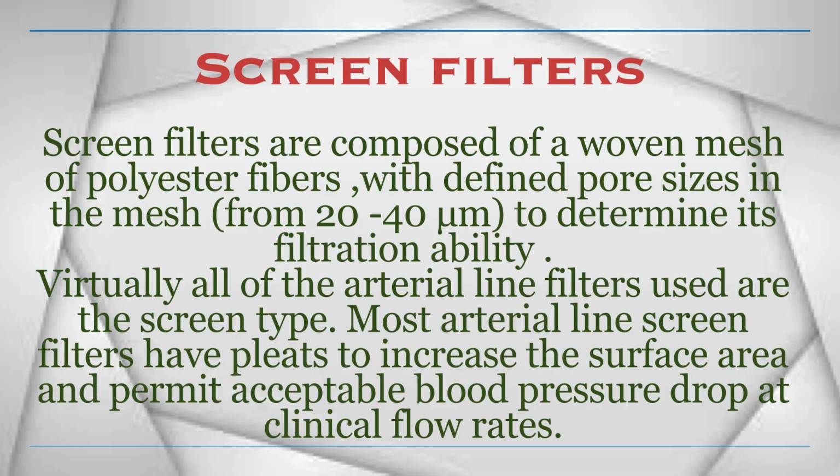Screen filters. Screen filters are composed of woven mesh of polyester fibers with defined pore sizes in the mesh, from 20 to 40 micron, to determine its filtration ability. Virtually all of the arterial line filters used are the screen type. Most arterial line screen filters have pleats to increase the surface area and permit acceptable blood pressure drop at clinical flow rates.